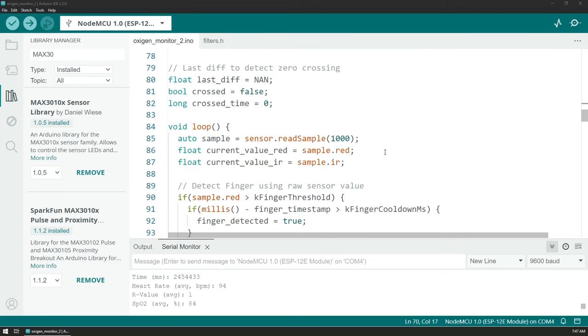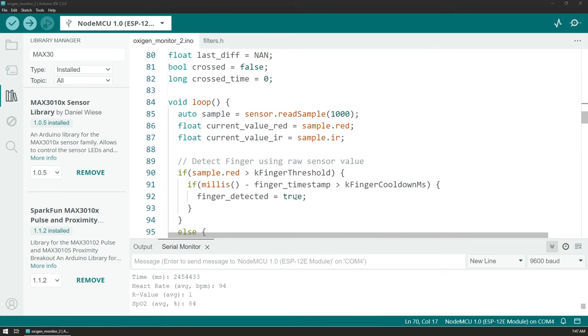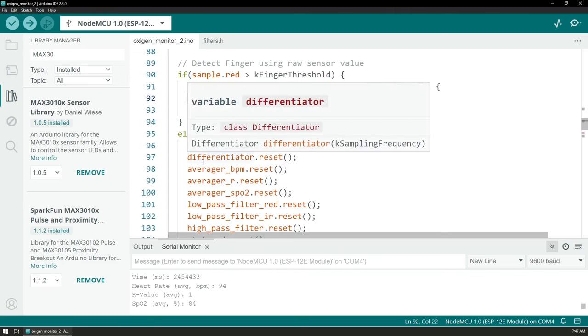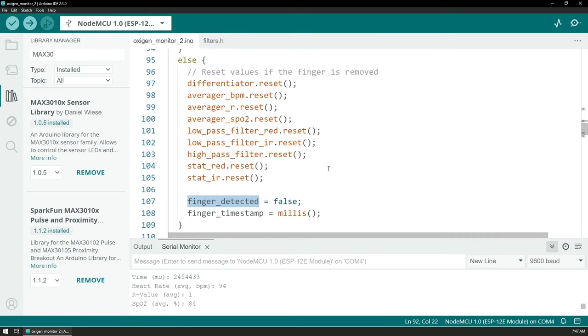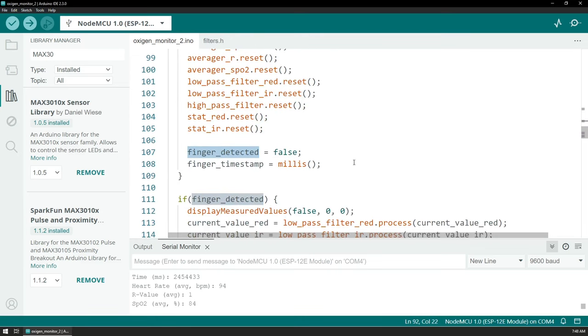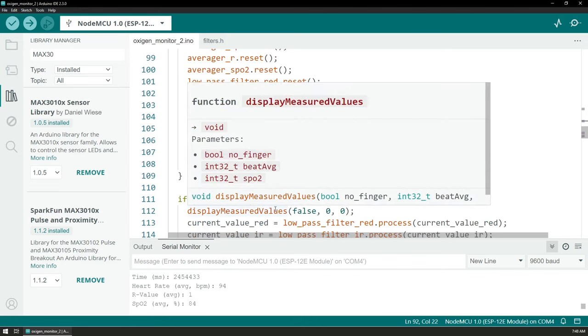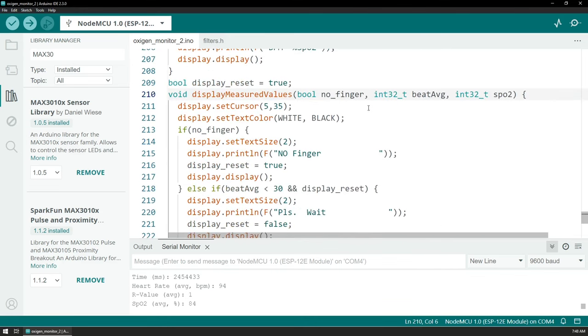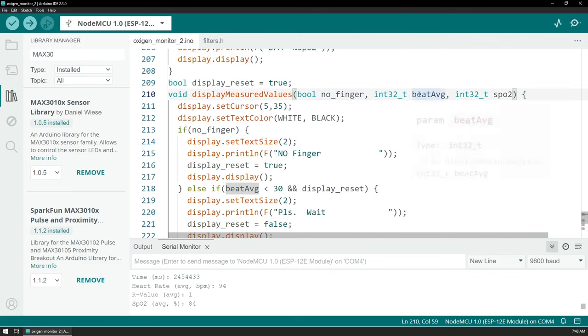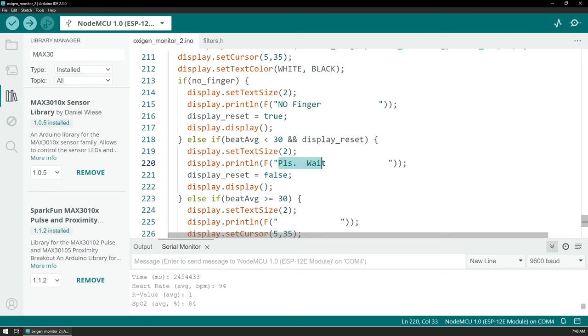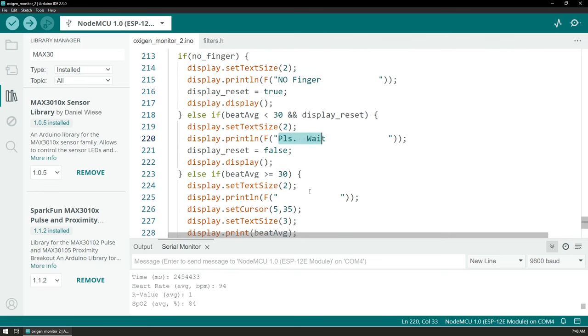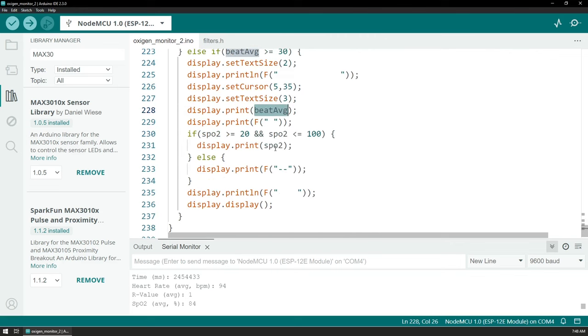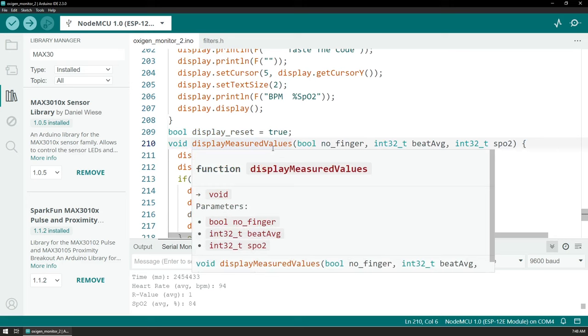Then in the loop function we're reading the samples and figuring out if we have a finger detected. If not, we are just resetting everything and start from the beginning. If we do have a finger detected, then I'm using the display measured values function to show the information on screen. Depending on whether we have a finger and what the values are for the beats per minute and the saturation, then I display the different information like saying that there is no finger detected or that we should wait, and finally displaying the right information for the beats and the saturation.